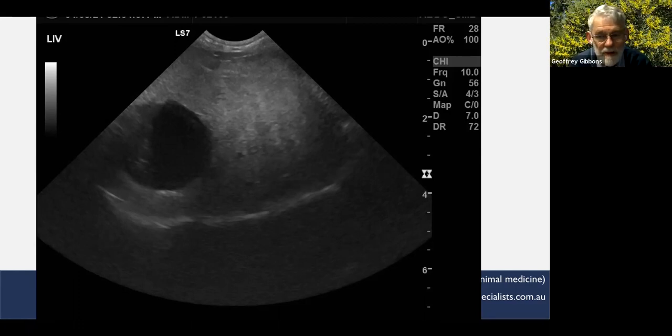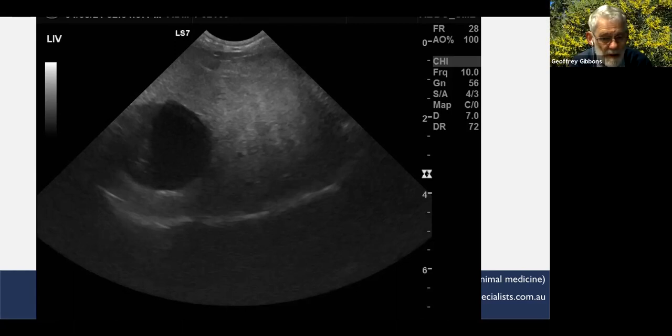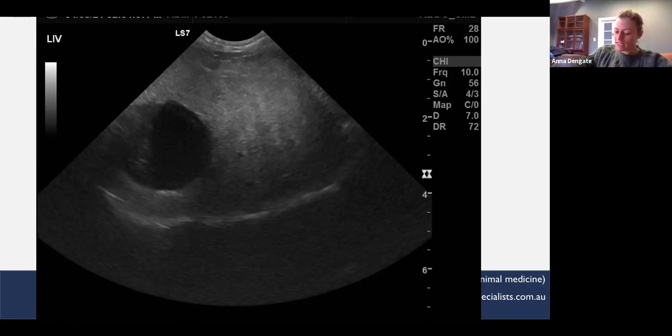Wall thickness. Good. Presence of sludge. Yep. Also presence of a mucocele. Yep. Distension. And the ducts leading from it, are they distended or not? Good. What shape should the gallbladder be? Probably a pear shape rather than a ball. Good, excellent. Yeah. So pear-shaped or teardrop shaped.